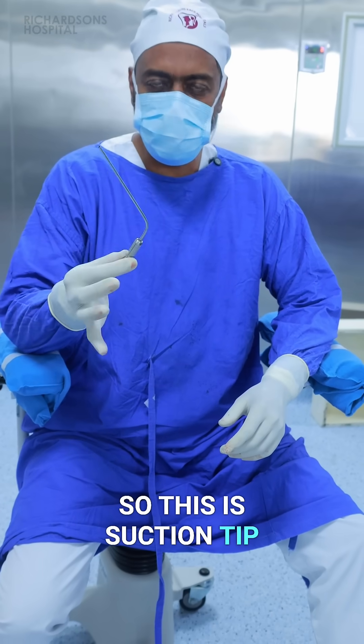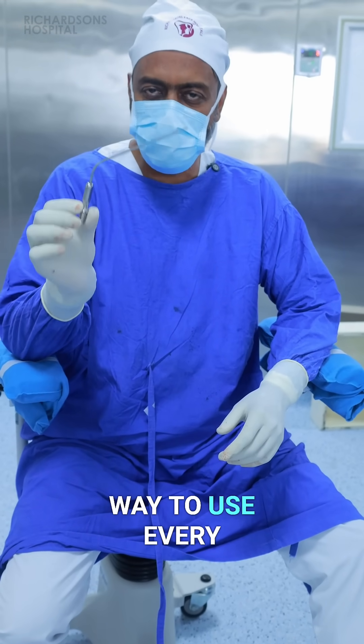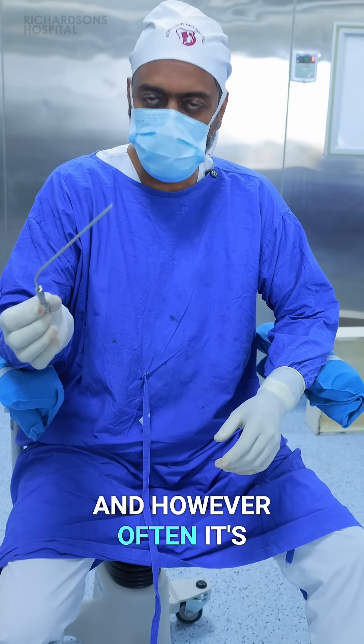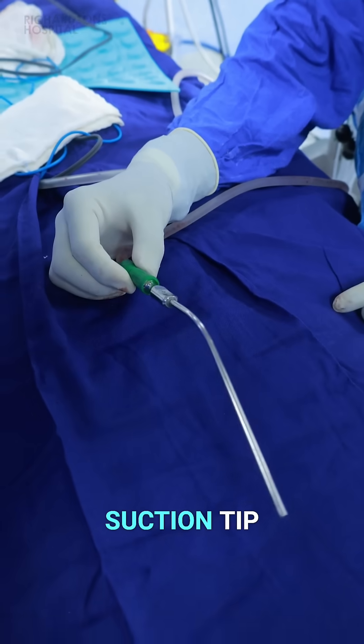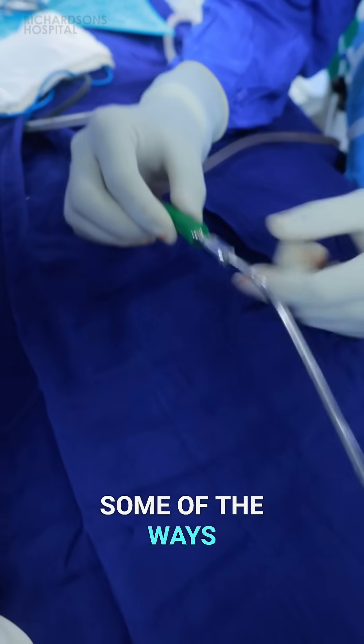This is a suction tip, very commonly used. There's always a best way to use every particular instrument, however common it is and however often it's being used. This is a suction tip — different variants come — and I'm going to show you some of the ways in which you can use it.